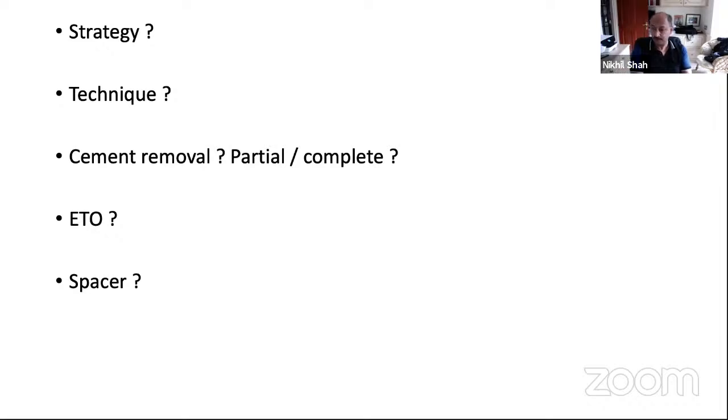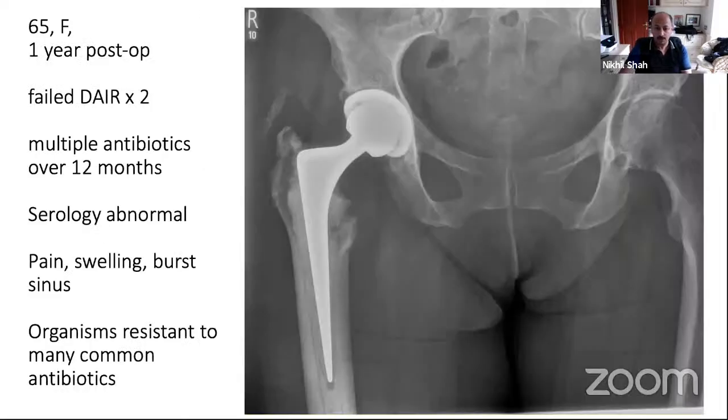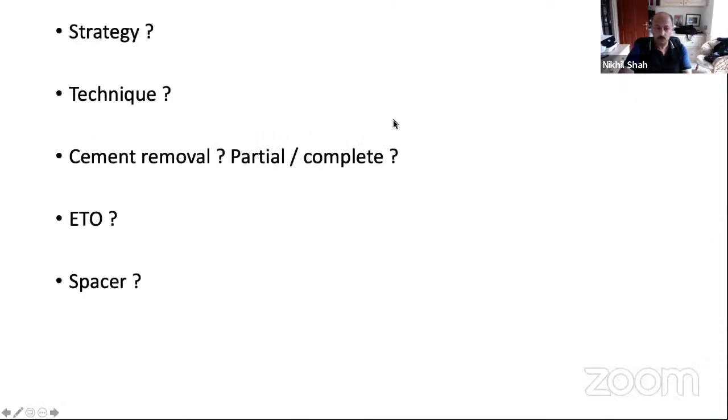What about an ETO? You can see that it's quite a long cement column. It's almost, I think, a 16 and a half to 17 centimeter cement column. So this was what we were talking about in the previous webinars, why I prefer to use a C stem in comparison to the longer stems such as the Exeter. The results of the Exeter are very good, but when you have to take out something like this, you get a 16, 17 centimeter cement column and an ETO then becomes almost inevitable. Whereas with the shorter C stem, you can get out cement from the top, or endomedullary cement extraction, without an ETO. So what would people do over here?